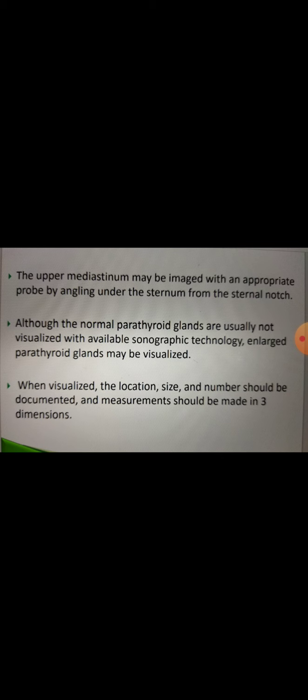Okay, now we will also talk about the color Doppler or power Doppler assessment of the parathyroid gland. Just remember that although spectral, color or power Doppler ultrasound can be helpful, sonography is also very helpful for the guidance of aspiration or biopsy of parathyroid abnormalities, or for the biopsy of any mass present in the neck, or for interventional procedures.